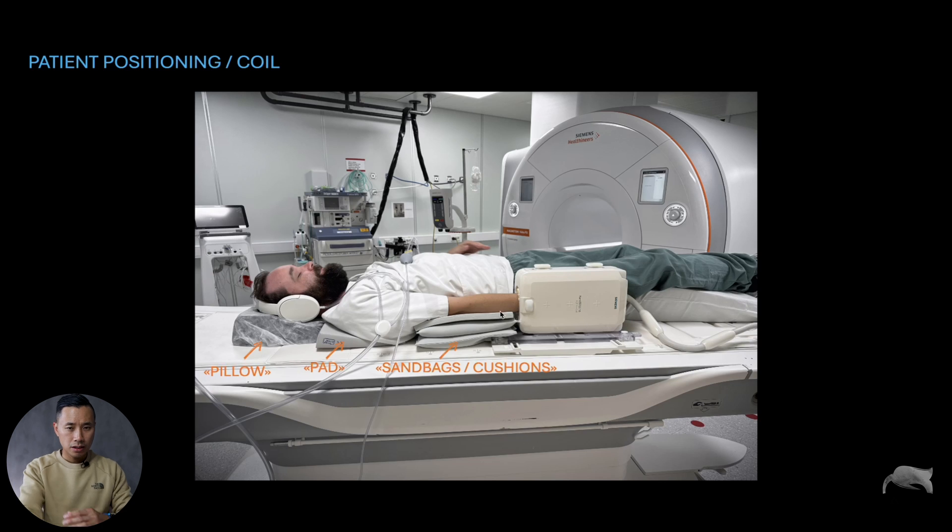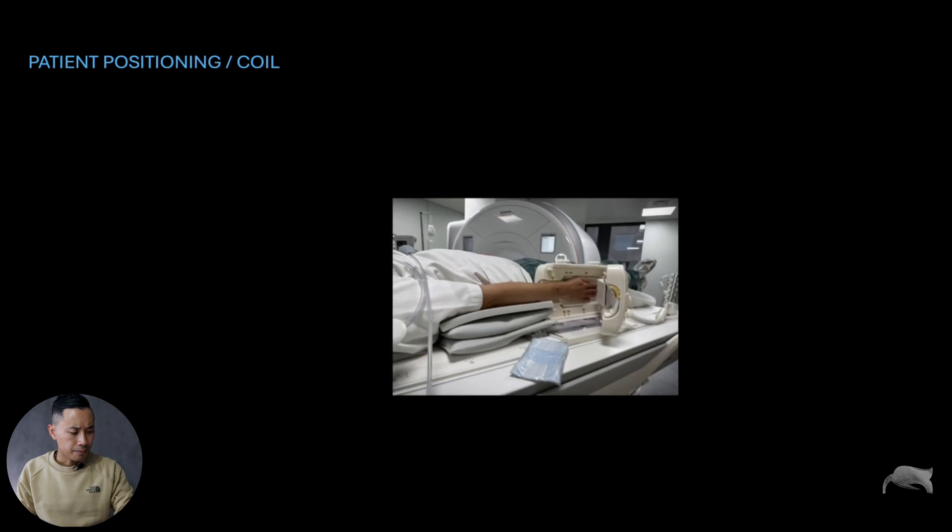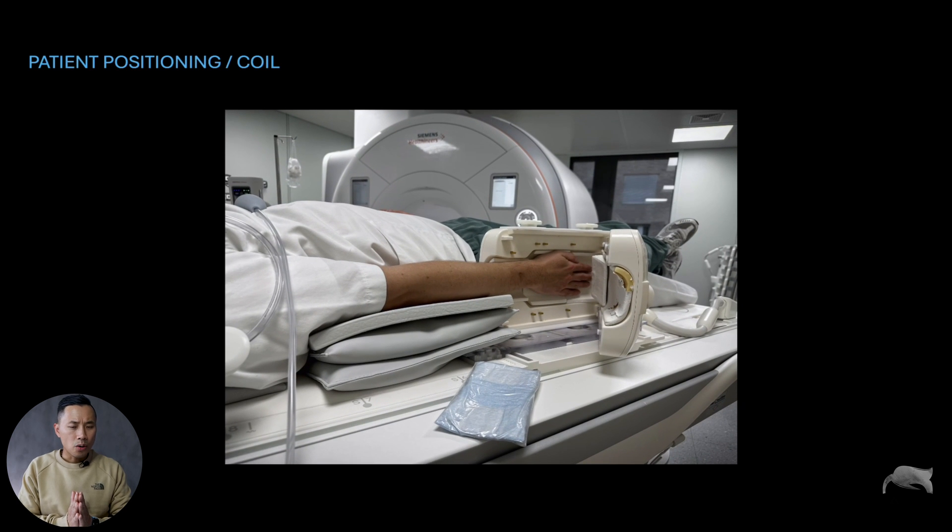We have some pads at the shoulder just to relieve pain, and most importantly the sandbags and cushion. You need to build the arm completely straight — 90 degrees straight with the wrist and fingers. You also have some cushions under the knee to relieve pain from the back. The other arm can go on the stomach or down to the side depending on patient size. Remember: do not let skin touch the bore due to MRI safety. Headphones, earplugs, and an alarm button should also be available.